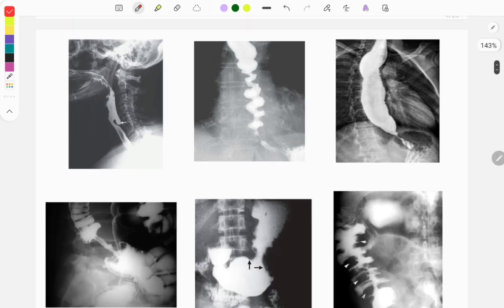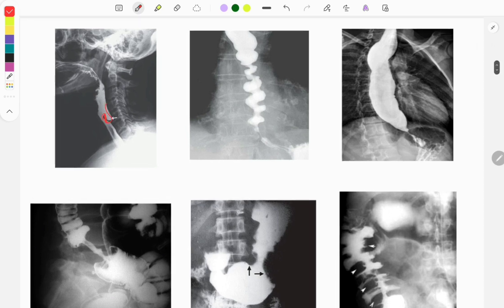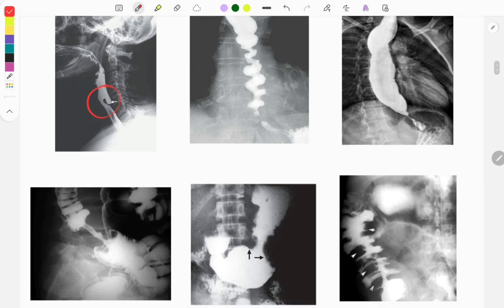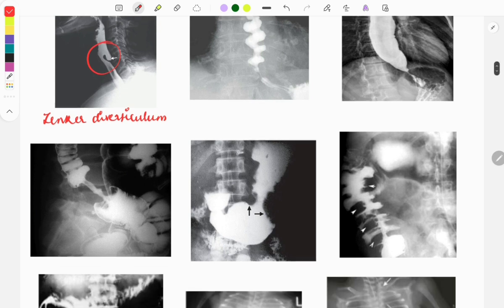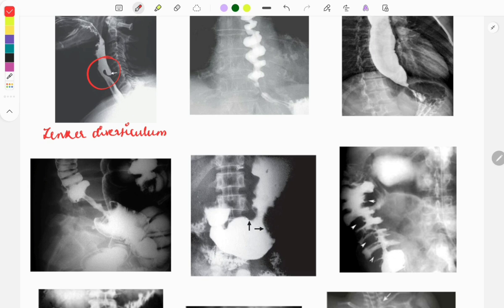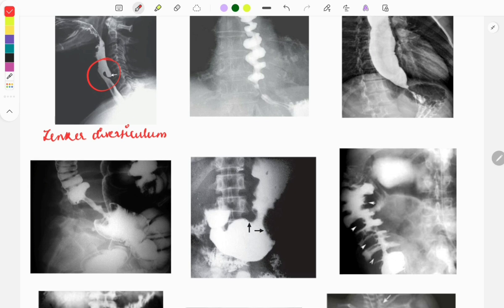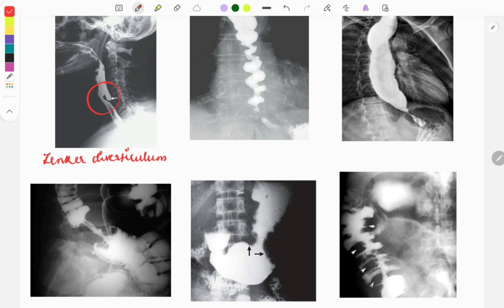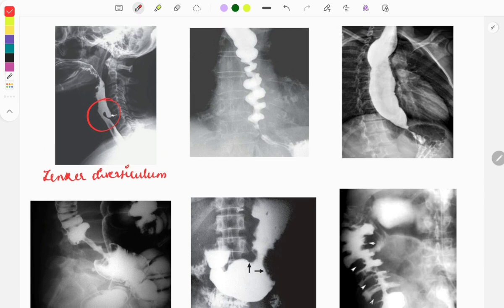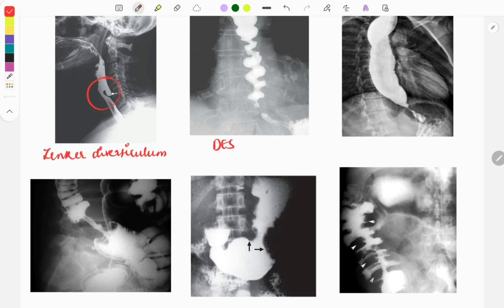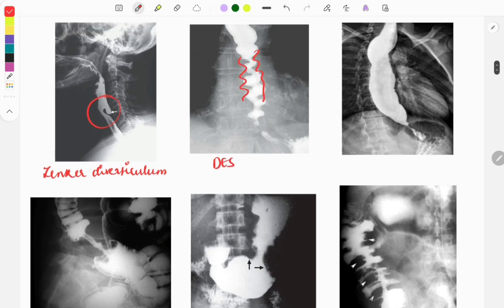Now we'll discuss important images related to the GIT — barium studies frequently asked in the FMGE. In this image you can see a pouch-like structure seen in Zenker's diverticulum, an esophageal disorder presenting with regurgitation of food, halitosis, and dysphagia. The next image is diffuse esophageal spasm showing a corkscrew appearance; it is a hypermotility disorder of the esophagus.